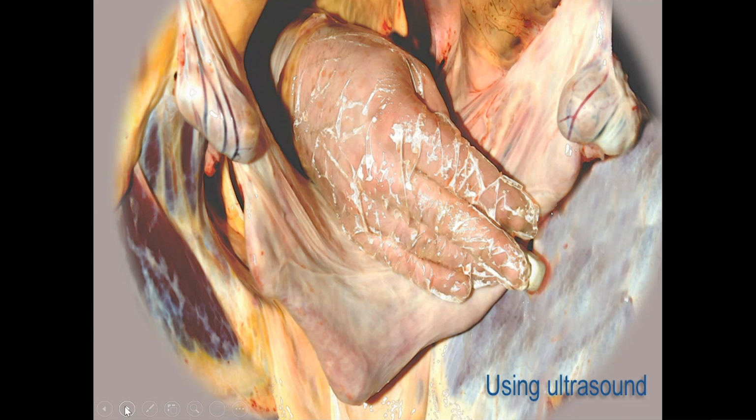I think this double procedure and the methodical nature of it helps me minimize the risks of things like missed twin pregnancies, failure to detect endometrial cysts, and so on, which we'll talk about in a subsequent webinar.